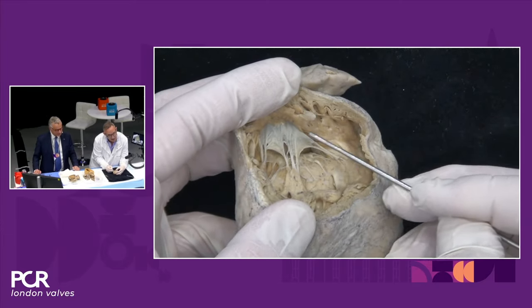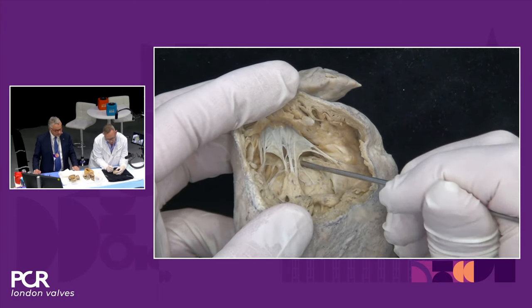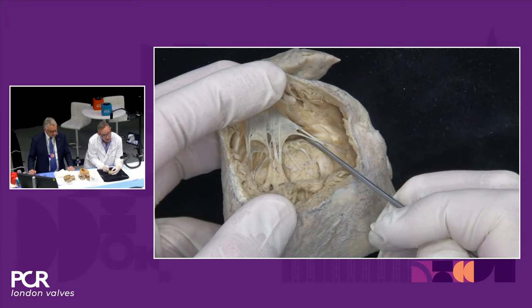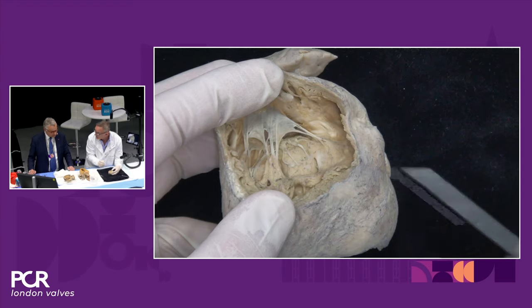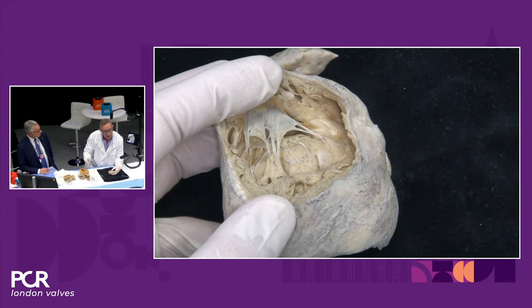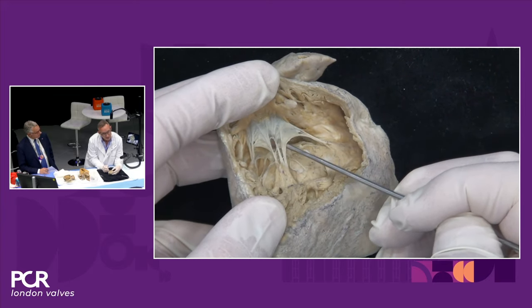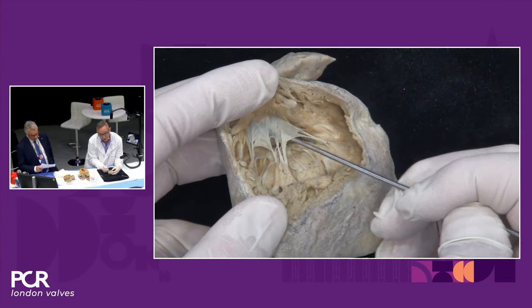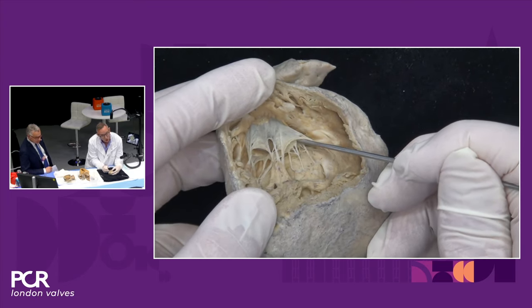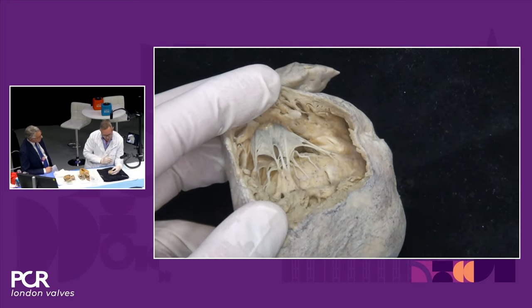So this is then the anterior leaflet. This would be the inferior posterior leaflet and the septal leaflet below. If you look at this anterior leaflet, you can see that there's a large cord-free zone in between those two points of attachment. This is the best area for clipping, and it's quite consistent across hearts. Unless you've got a really small anterior leaflet, that is the largest cord-free area for clipping. If you look underneath on the septal leaflet, you'll see there are multiple chordal attachments as I lift that up, so much narrower regions in between the cords.